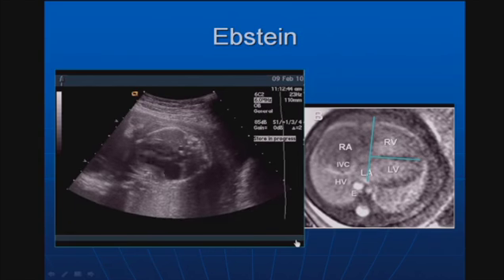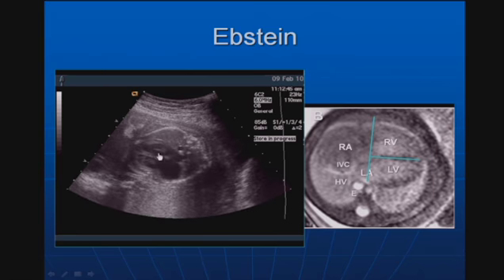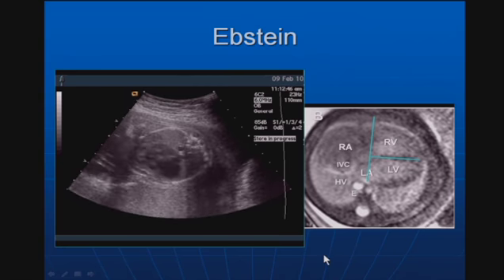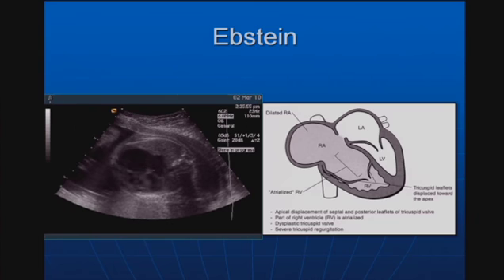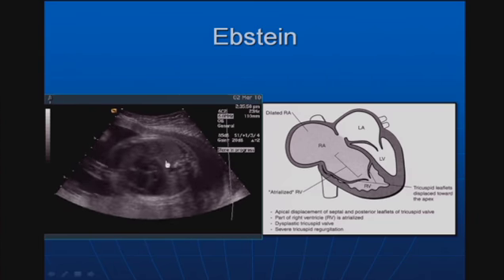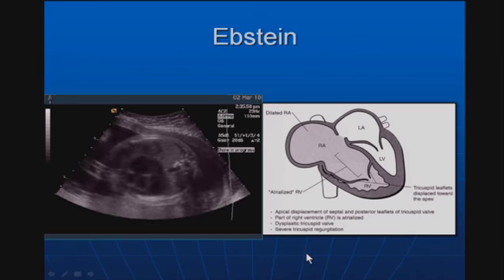We wait 4 weeks, and by 4 weeks later, you can see here the axis is quite abnormal. We're starting to get dilatation of the right atrium. This is a case with an in utero fetal ultrasound showing an enlarged right atrium and an abnormal axis. 4 weeks later, we can see this quite easily where there's dilatation of that right atrium and the axis is very abnormal.